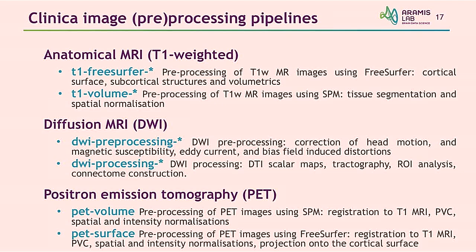From that, you can extract voxels, vertices, or regions. And again, it's just one command line, where you pick the pre-processing you want. You specify the input and output folders, and that's pretty much it. You don't have to tune any parameters because we've made these choices for you, and we pick the parameters that we found to be optimal.